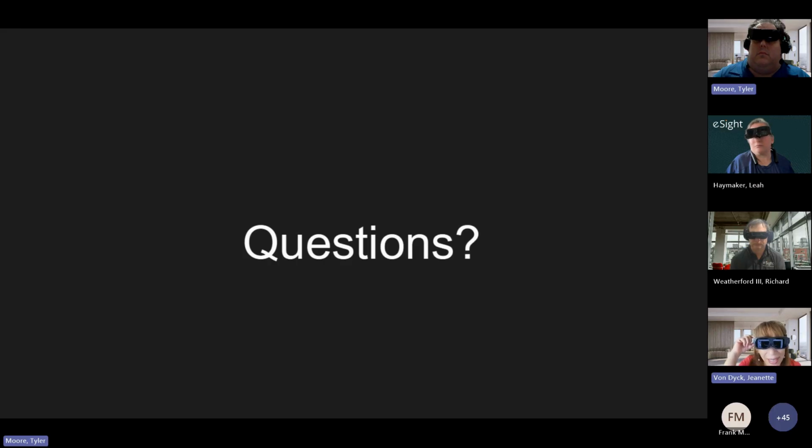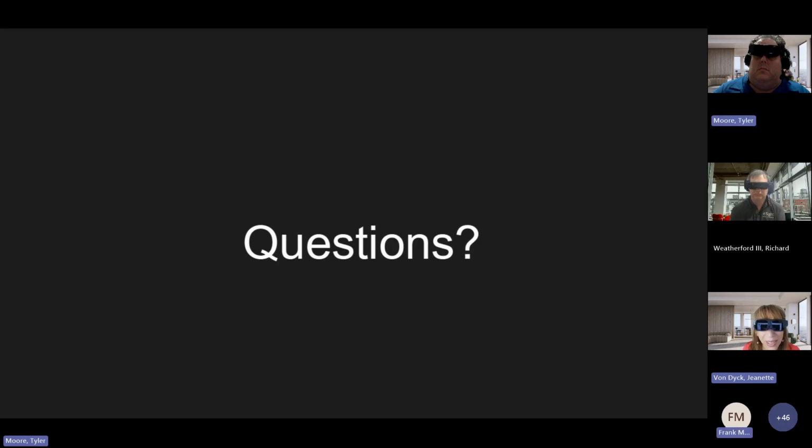It's the button at the very back nearest to your ear on the right-hand side. Go into the menu, go down to support, go into support, and there should be a check for updates in there, and you can press that as well. It's a little more complex than just having it come up with the prompt for you.